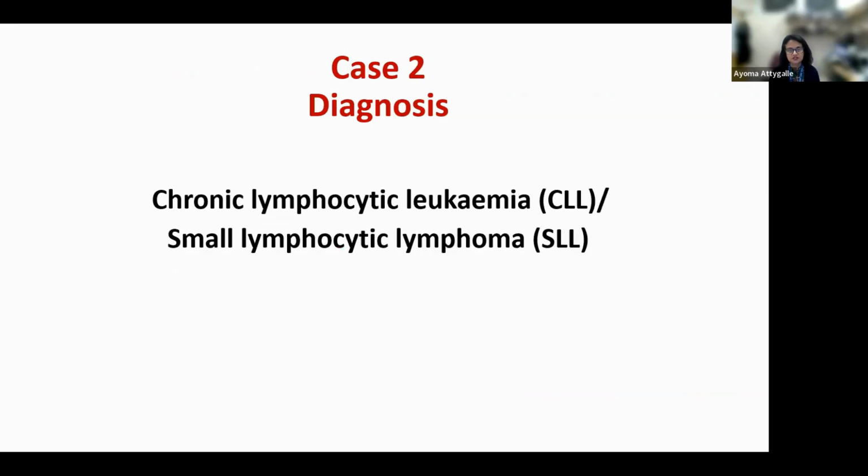The diagnosis in case 2 is CLL-SLL, and the reason why these cases are biopsied is often an incidental finding of a lymphadenopathy when they are assessing the patient for something else. Sometimes the clinician has not even bothered to do a full blood count. If there is a raised full blood count with lymphocytosis, and the lymphocytosis is due to the CLL, then there's actually no need to do the lymph node biopsy.